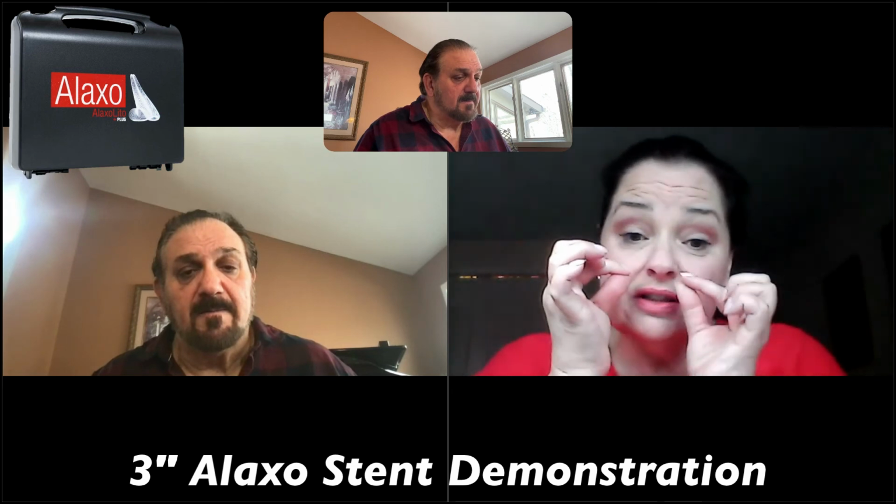You're just going to feel that extra feeling in your throat. When you put it in and get to that solid spot, and then go lateral left, you find your spot, because noses are like snowflakes. They're all just a little different. So you find your spot and you get it. And once it gets there, it's like, oh, okay, it's in.